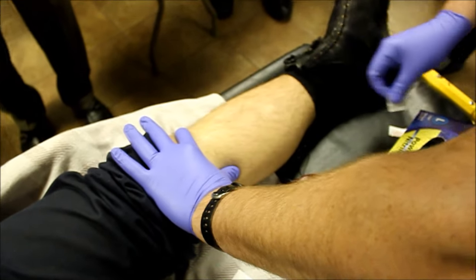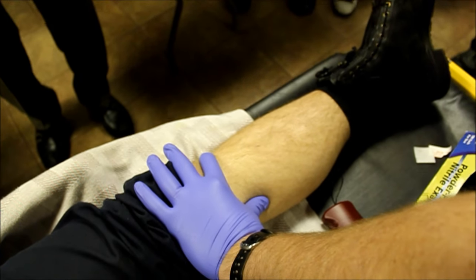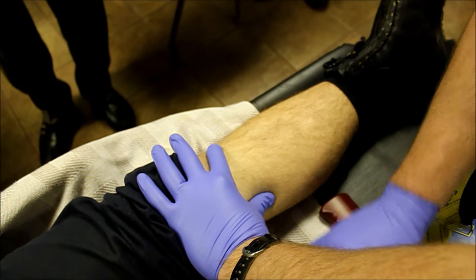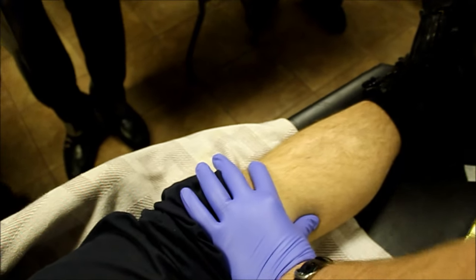Now it varies because you guys are out in extreme temperatures, out in the rigs or in the fire trucks — cold weather — that affects the battery cycle a little bit on some of them, so it might be more or less. In the hospital they last long, but you guys are outside in the heat and the cold, and the extreme temperatures might shorten the battery life a little bit. That's a new driver.